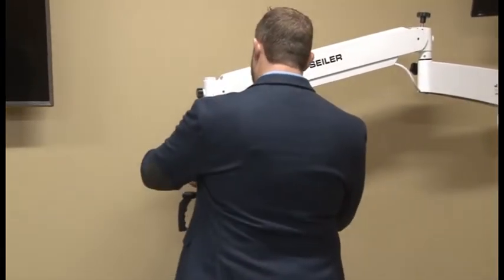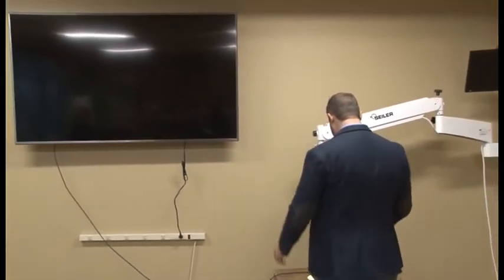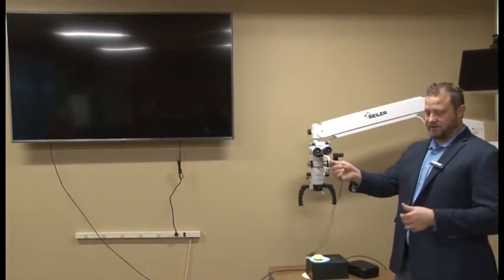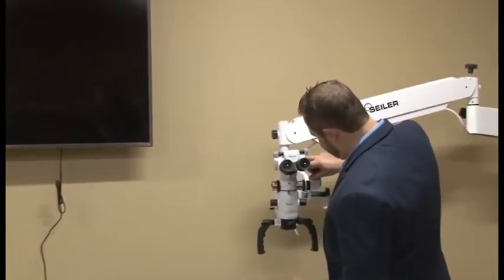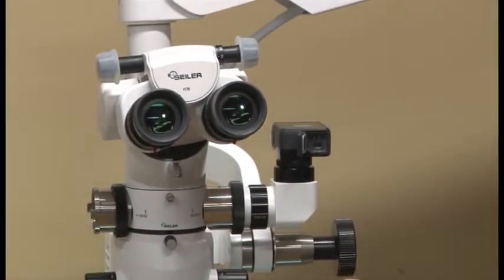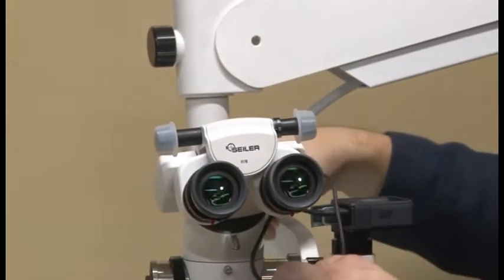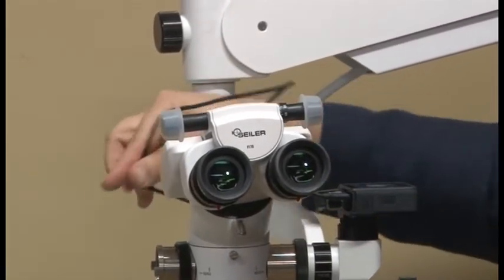Let's go ahead and turn on the microscope. I'm going to go ahead and charge. It comes already equipped with the USB power supply. So if you ever need to charge it, it's just right here — it goes on the top. Take the USB, plug it right there.